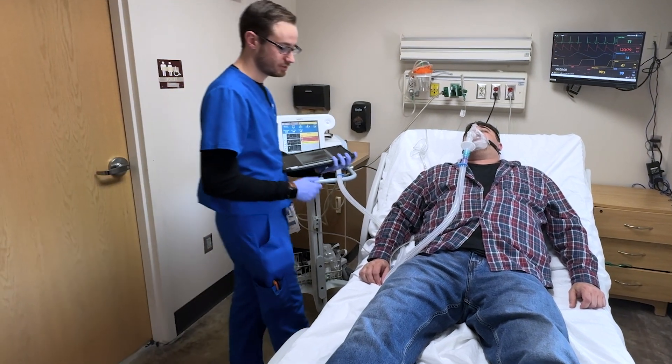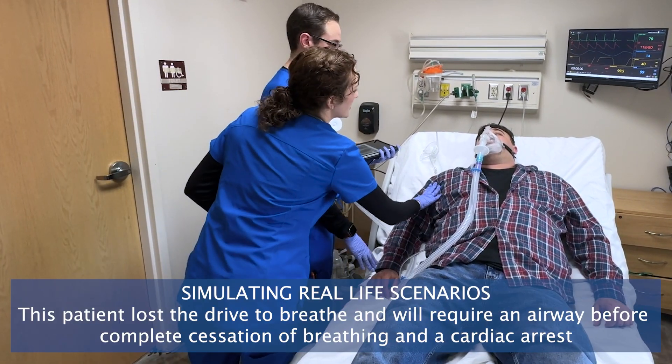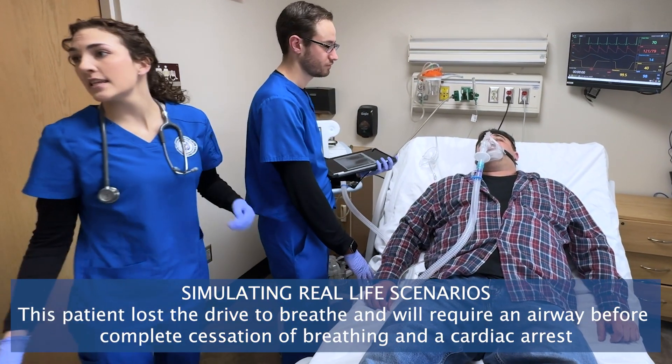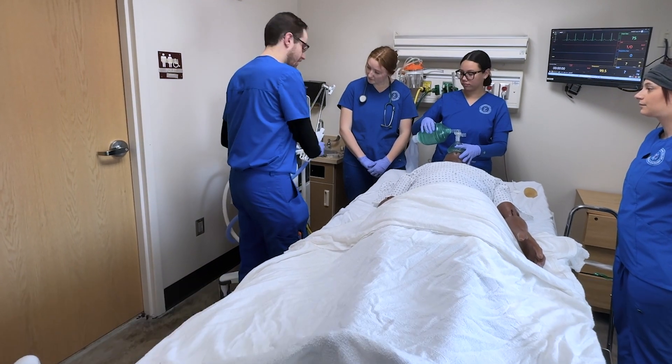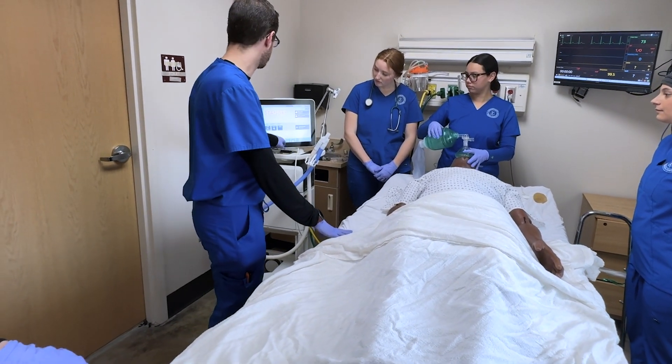Alright, Mr. Anderson, we have your results. Let's get the team in here — we need to intubate. Alright, I'm going to put him on the vent. I'm going to give him a tidal volume of 400 and a PEEP of 8 for his perfusion.